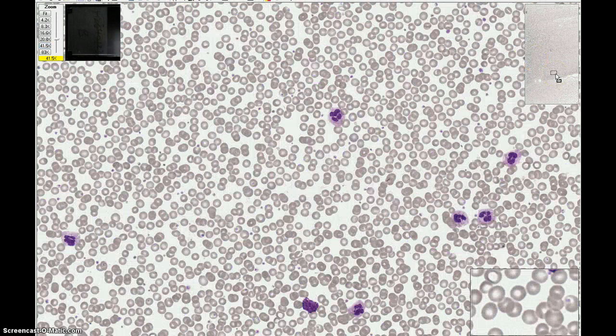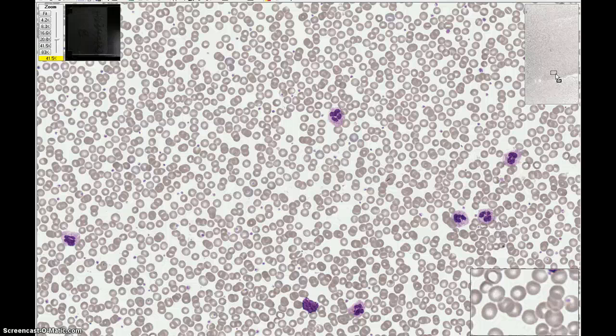A good area for blood cell examination would be an area where the red cells are evenly distributed with evidence of central pallor, which we see here. Now that we're in a correct area for blood cell examination, let's take a look at some of the white cells and identify them.